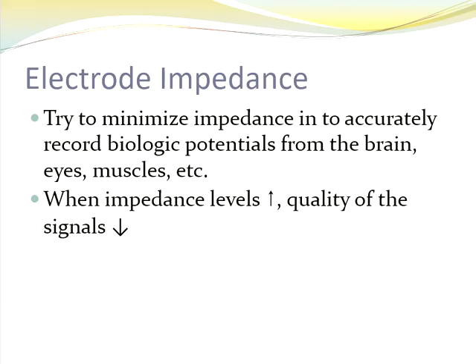As you continue to practice, what I'll have you do is start practicing with the computer and learn how to check your actual impedance levels, because knowing how to check them and then knowing how to fix them, recognizing which ones need to be fixed, that's all a skill that you need to start being able to pick up on, because that's part of your assessments and it's a huge part of ultimately your career in sleep.